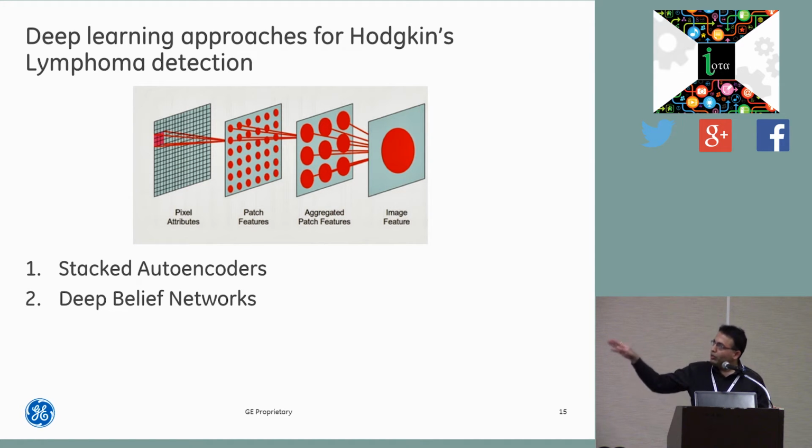As the deep network progresses through multiple layers, it will start learning features depending upon all those 8 factors that I listed, and probably dozens or even hundreds of other features that I, as a human, or other people, would not have been able to discern readily. And eventually, the aim is that you have this network deep enough so that it's fast to learn and fast to predict, and yet you get a high level of accuracy.